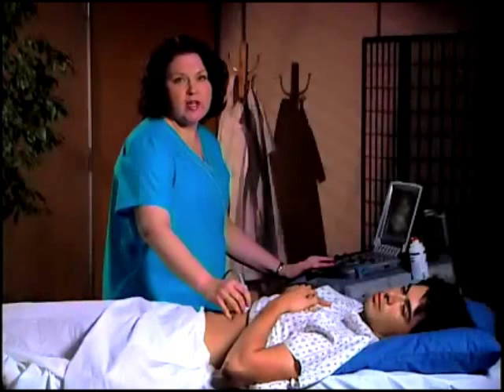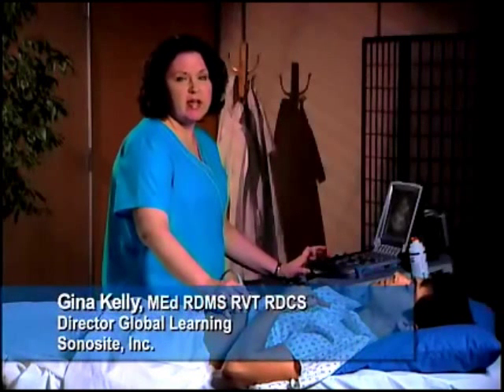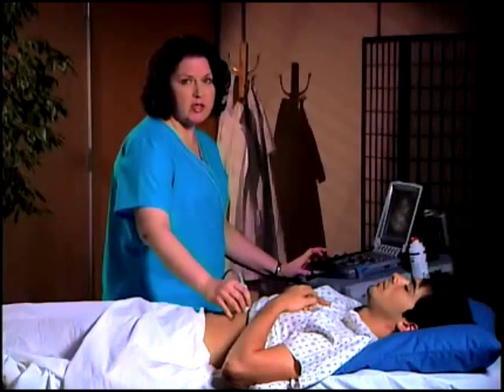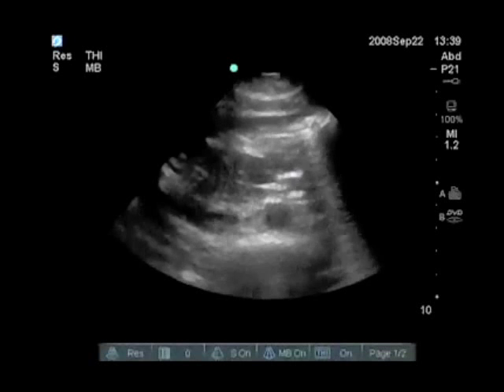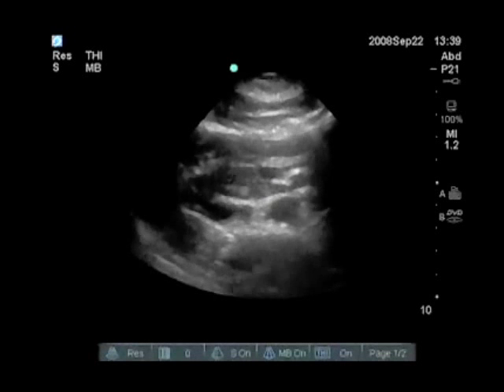Once we've done the survey, we want to go back and take measurements of the aorta in a transverse view at 3 levels. One level is proximal, above the level of the renal arteries. The second is just at the level of the renal arteries. And the third is at the level of the bifurcation. We're going to go back to the epigastric area and look for our landmarks again.